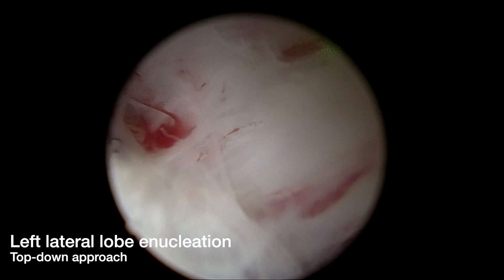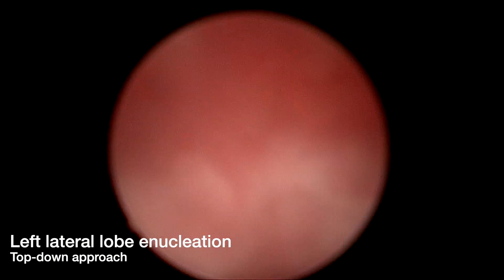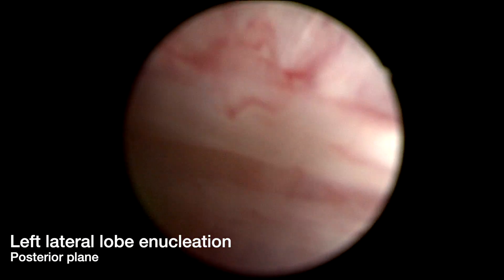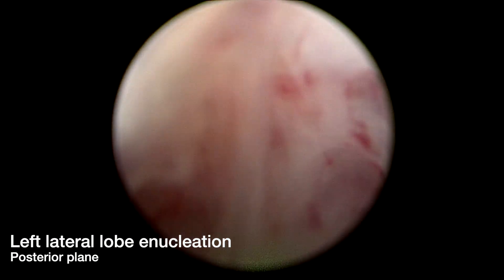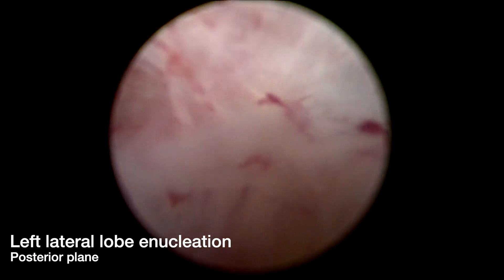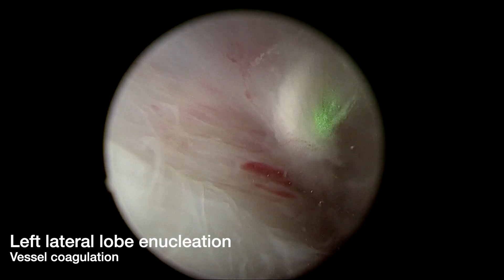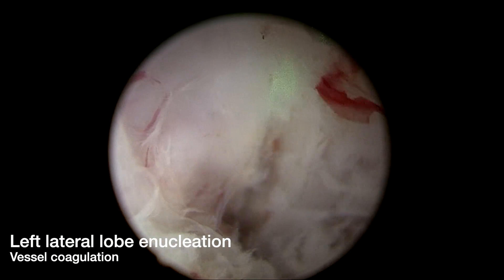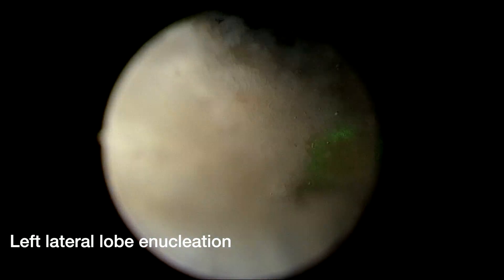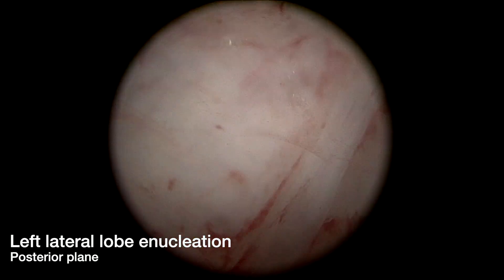Following this, we perform left lateral lobe enucleation using a top-down approach. The laser fiber is employed intermittently to further develop the dissection plane as well as to help with hemostasis. We have gone around the left lateral lobe and are bluntly dissecting the posterior plane. For bleeders, we defocus the laser fiber and coagulate the vessel. We continue enucleating the left lateral lobe and develop the posterior plane until we reach the bladder neck.